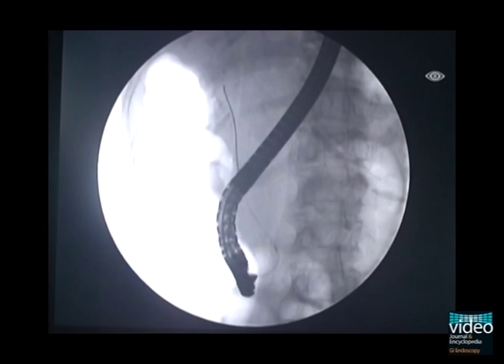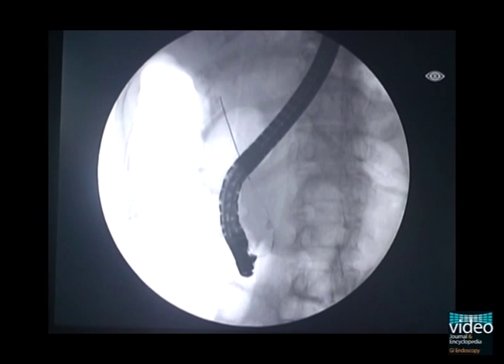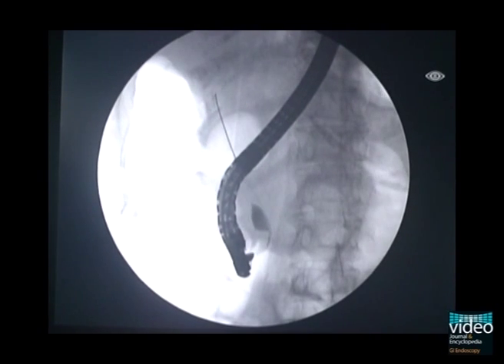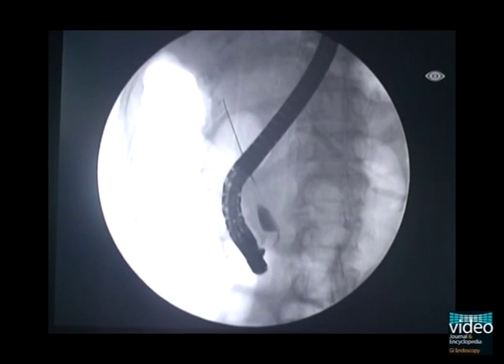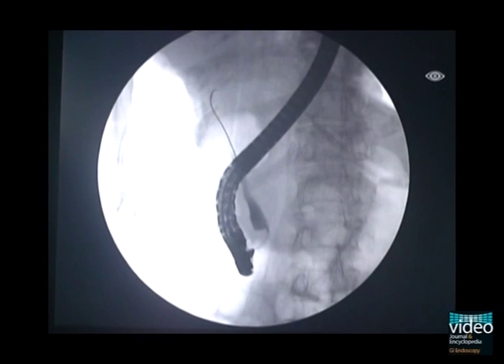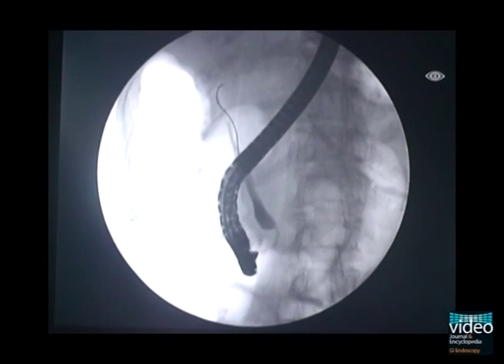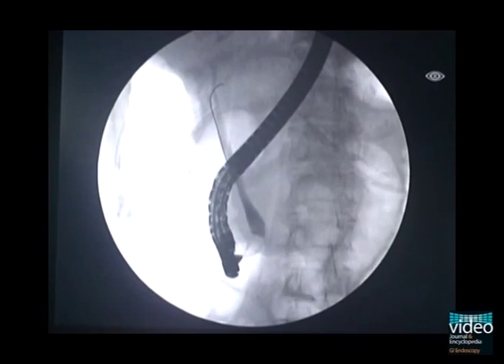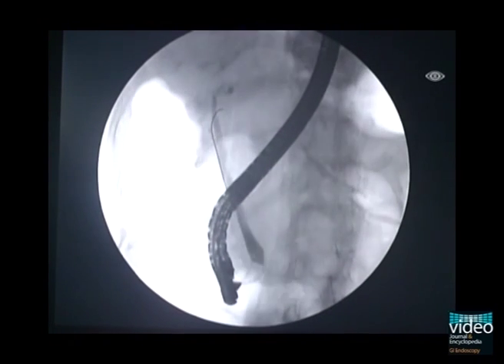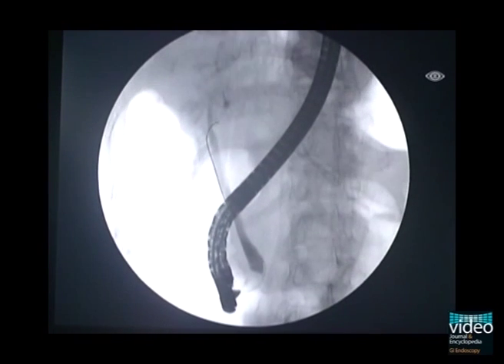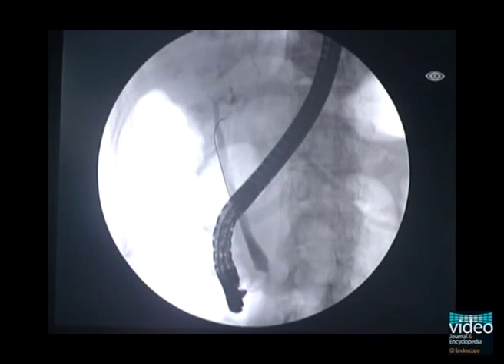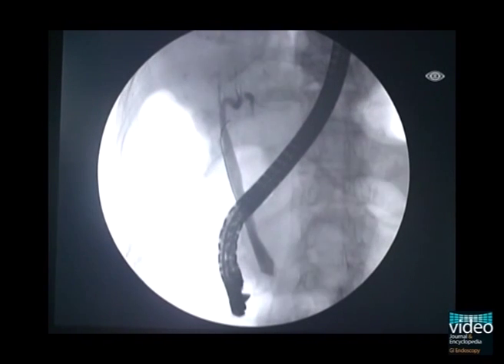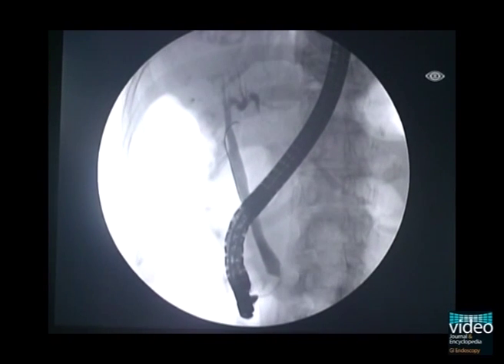ERC shows selective CBD cannulation using a JAG guidewire preloaded pull-type papillatome. After successful guidewire placement into the CBD, contrast injection into the CBD was done to search for the cystic duct. At the same time, the cystic duct is negotiated by to-and-fro motion of the guidewire, as shown.